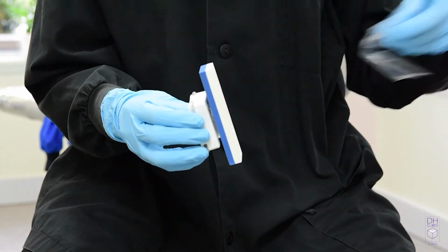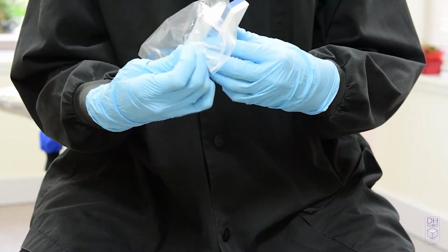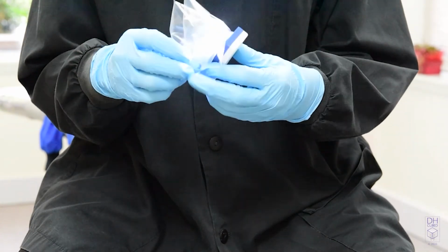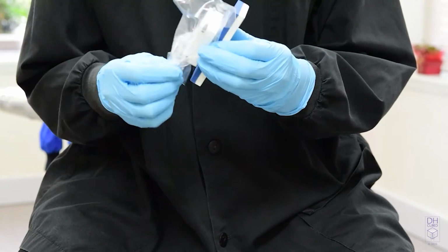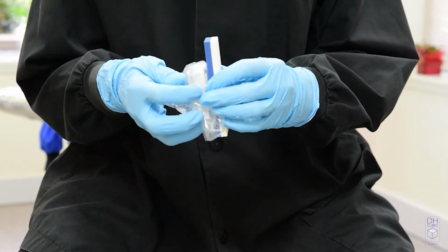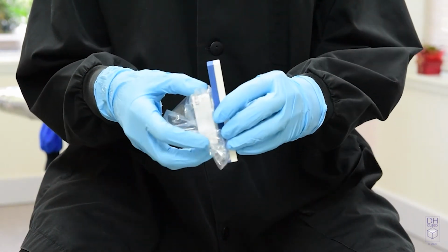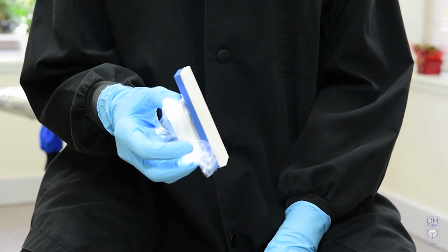Another barrier that you can use is the barrier that you use on your light handle. Slips over, get the excess out of the way, and then again you could either hold it on the side or you can hold it on the top, keeping your fingers away from the possibility of exposure.